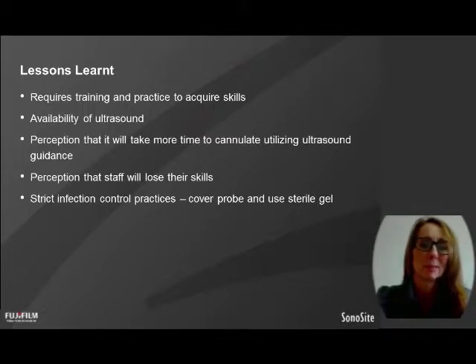There is also a bit of a perception that staff will lose their skills. I find that actually the opposite. When you are using the ultrasound in the dialysis setting, you learn what you are feeling. You learn more because you can actually see, and you learn a lot more about what an unusual thrill feels like. What does that mean? You learn to assess better, you learn to cannulate better, and it makes me, and certainly other staff that I know that use ultrasound, better cannulators with and without ultrasound.